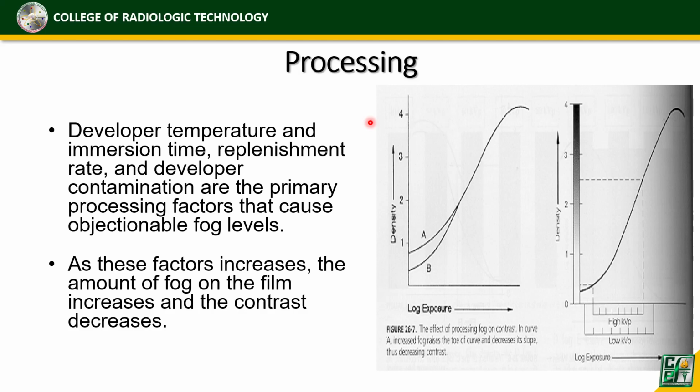Nakuha po ba yun? Naintindihan po ba yun? Kapag ang developer ay contaminated, kaya sa manual processing, meron silang sarili-sarili niyang paddle panghalo ng solution, pang-mix ng solution. Yung developer paddle pang developer lang.